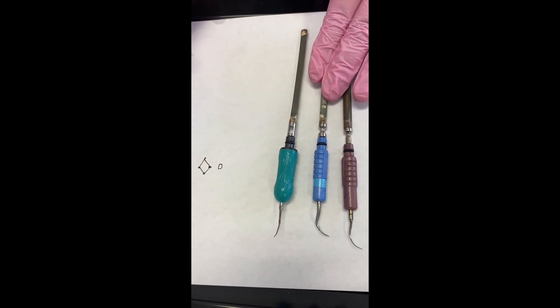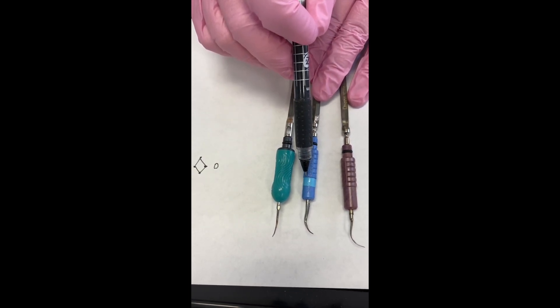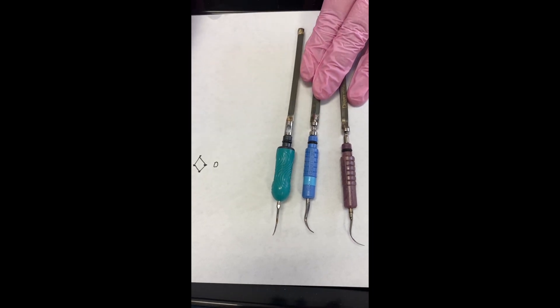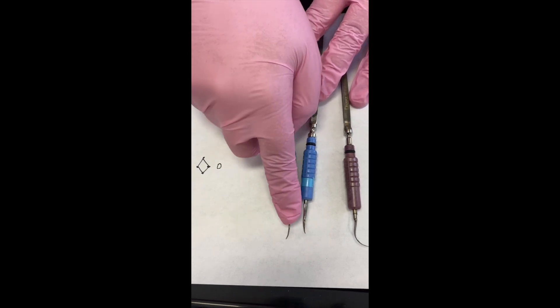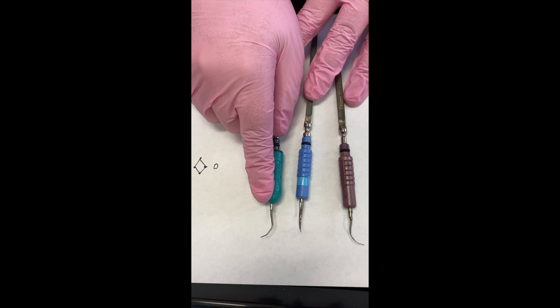Ideally, when you use your blue or diamond cross-section tip, you want to use it supragingivally or just a little bit subgingivally to get the big, bulky calculus off. Then when you go subgingival on the root, you want something with a round cross section — it's a little bit more gentle on the root.